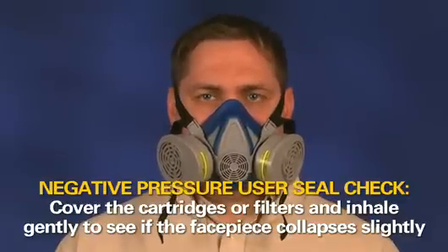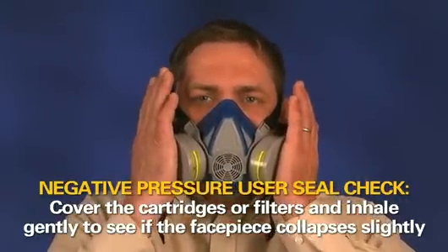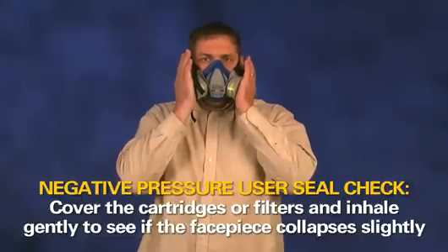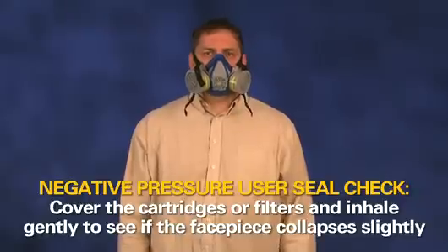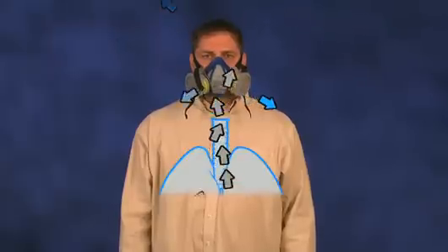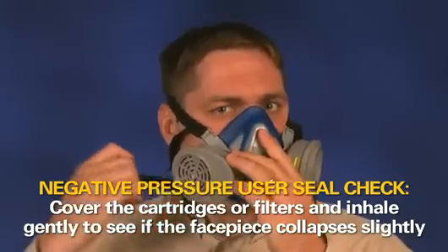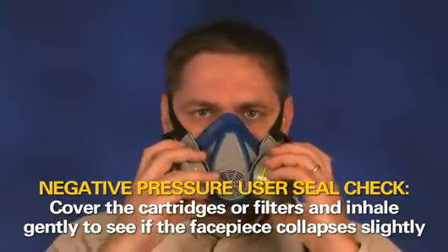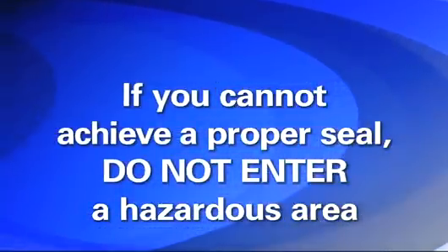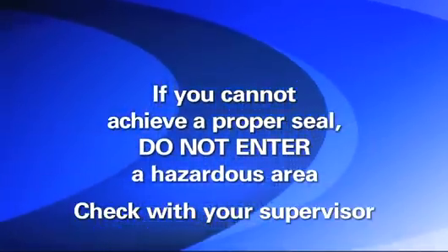Next, perform the negative pressure seal check. Cover the respirator cartridges or filters with the palms of your hands. Inhale gently. If you feel the face piece collapse slightly and pull closer to your face with no leaks between the face and face piece, a proper seal has been made. If you detect face seal air leakage, reposition the respirator on your face and readjust the straps, then recheck. If you cannot achieve a proper seal, you are not protected and should not enter a hazardous area. See your supervisor to determine what the problem may be.